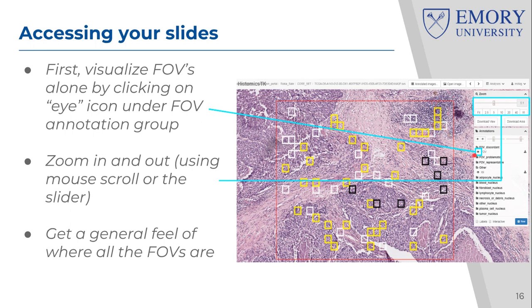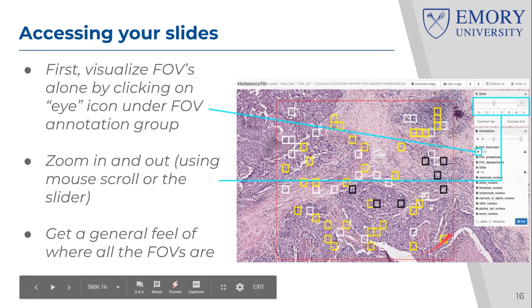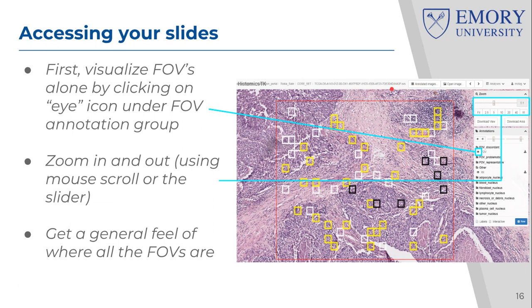But again, the first thing you need to do is click on the eye, make sure you see these fields of view, and know how many of them there are, where they are, what their colors are, and so on. You'll notice that these FOVs have different colors, and don't worry about what they mean. These are cues that I used to pick these fields of view. They were picked automatically, but based on some objective criteria that I set. The yellow ones were picked under certain criteria, the white ones under other criteria, and so on. So don't worry about what the colors mean. Just know that if it's a field of view, then it needs to be annotated.